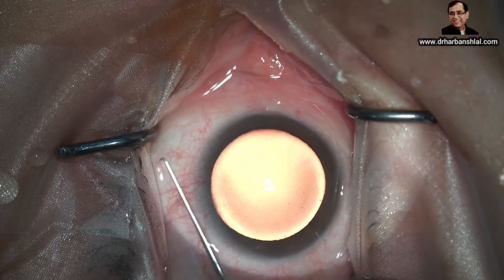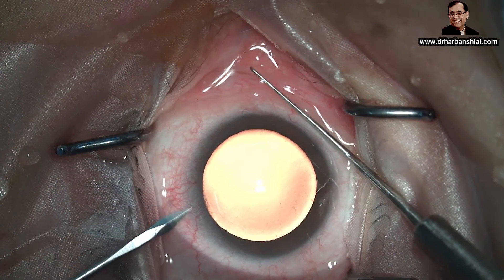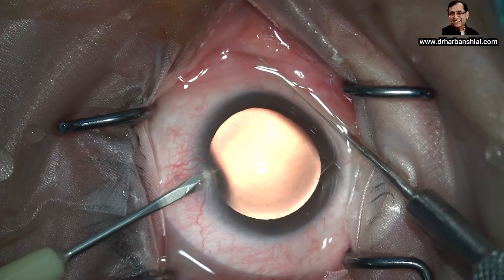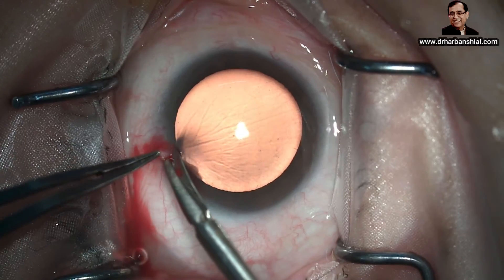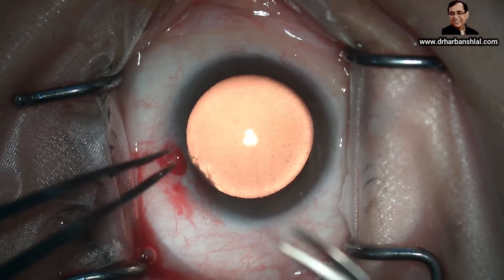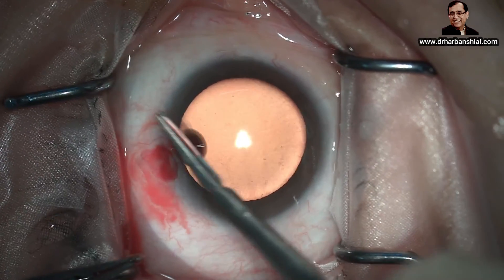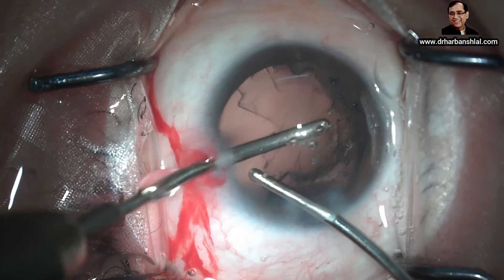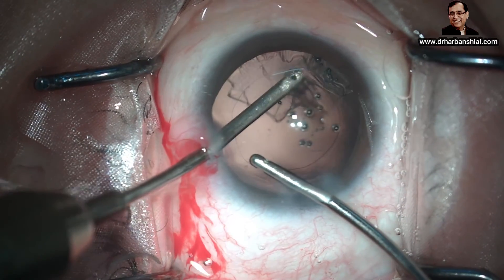If by any chance you have cut the conjunctiva — as in this case where the conjunctiva was overriding — the outer lip of the incision should not be covered by conjunctiva, because when fluid regurgitates it will cause chemosis there. We are cutting the conjunctiva to prevent chemosis. Even so, once we start irrigation and aspiration, you can see some chemosis developing on the inferior nasal side of the incision, where some conjunctiva still covers the incision, but it should cause no problem to the patient.